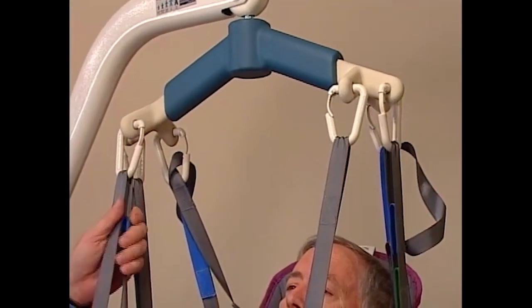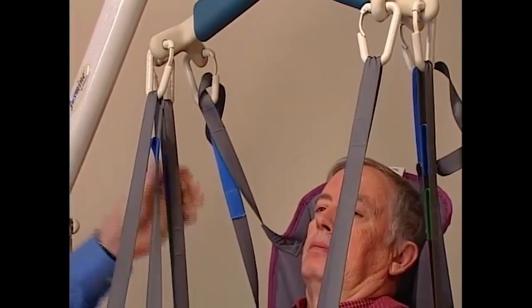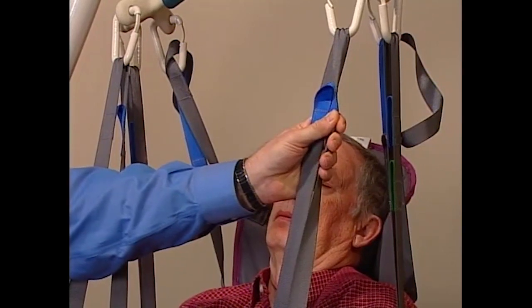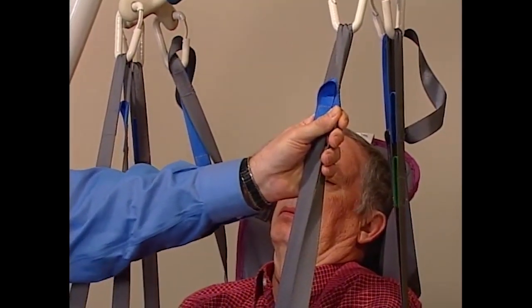Toileting slings attach to the lift with either four or six straps for easy positioning. They're reinforced at all points of attachment for safety. Each strap has a series of color-coded loops sewn into them, which allows the caregiver to situate the resident in a variety of positions, from full recline to full upright.